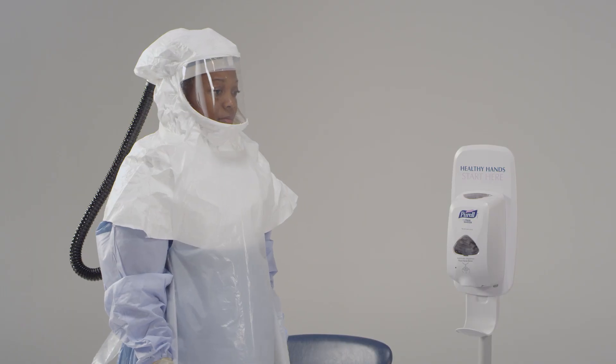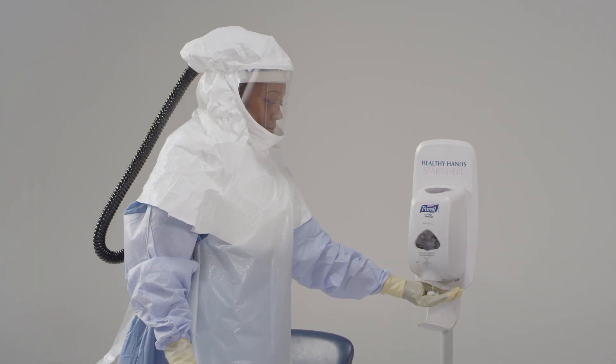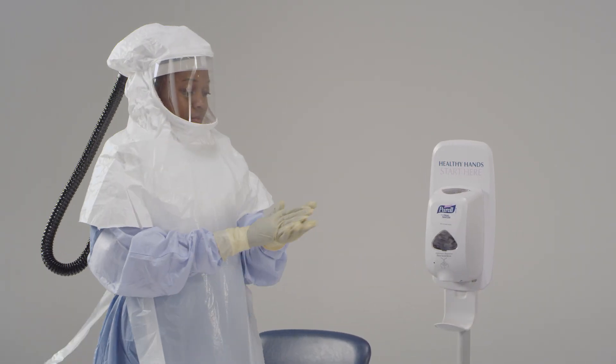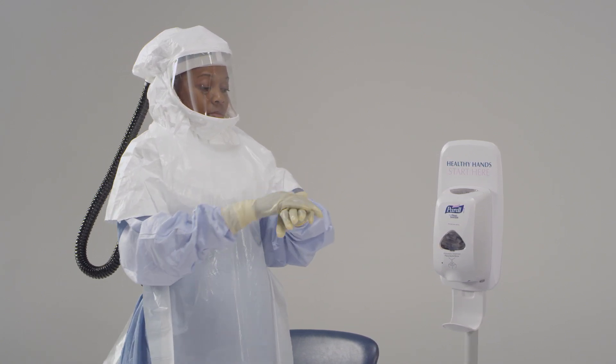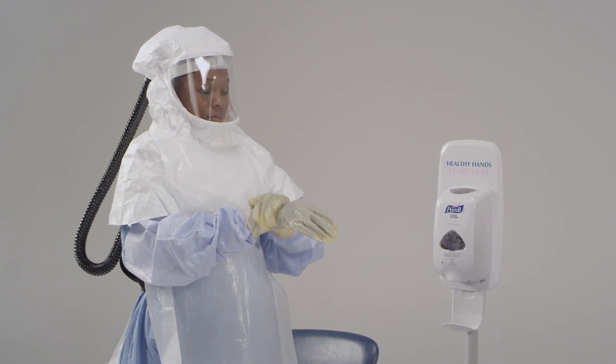Now I'd like you to disinfect your outer gloves. Use an EPA-registered disinfectant wipe or an alcohol-based hand rub to disinfect your outer gloves. The wipe will be used to remove any visible contamination.